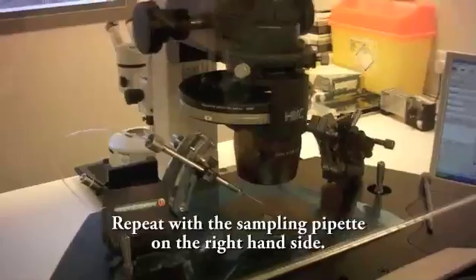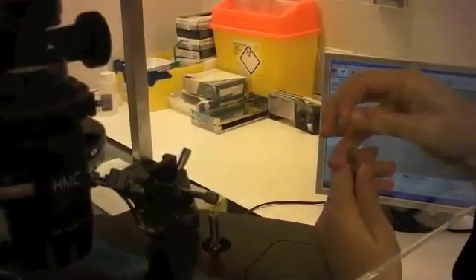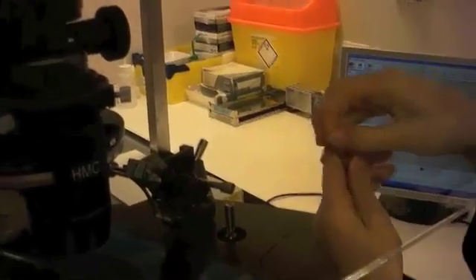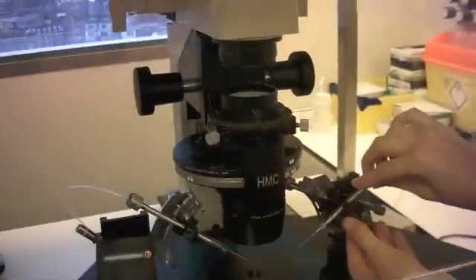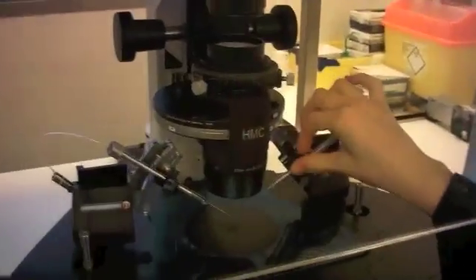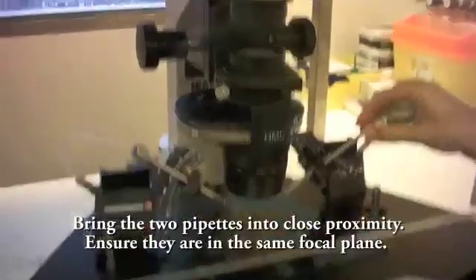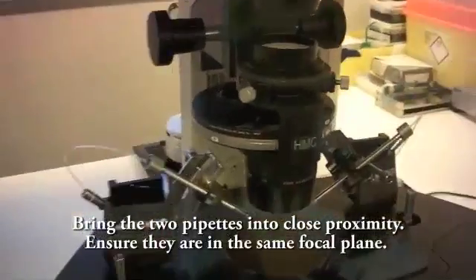Repeat with the sampling pipette on the right hand side. Bring the two pipettes into close proximity. Ensure they are in the same focal plane.